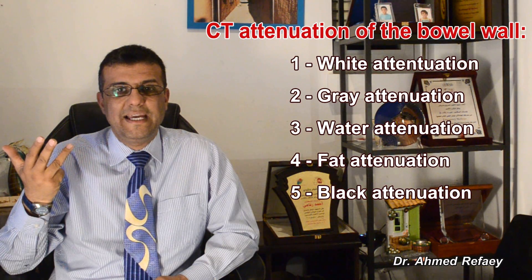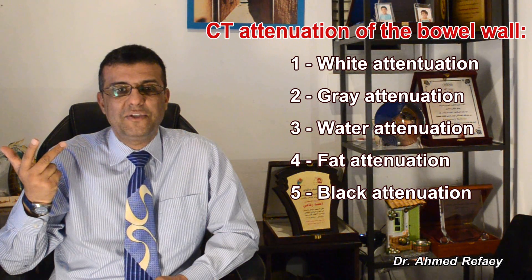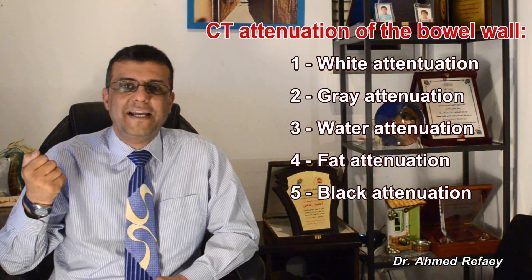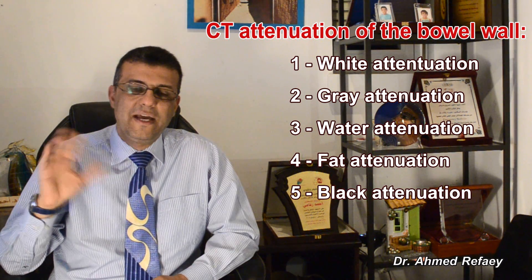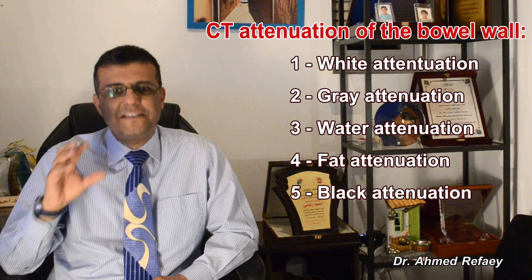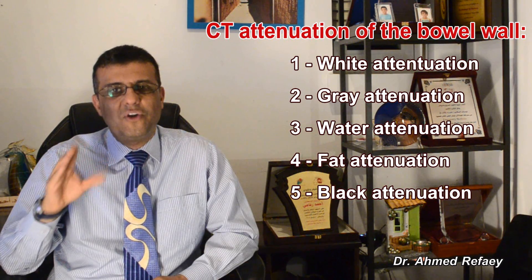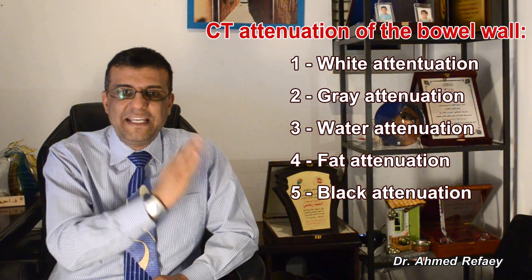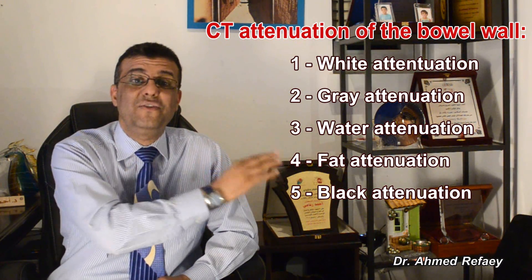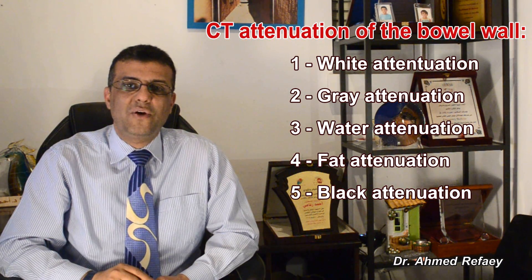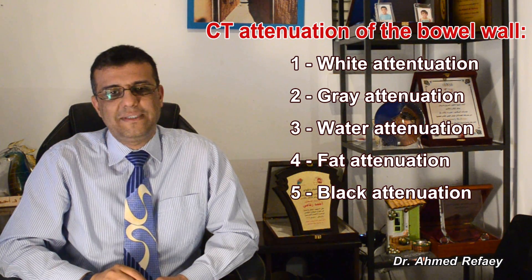The last differentiating feature is CT attenuation of the bowel wall. There are five categories: white attenuation, gray attenuation, water attenuation, fat attenuation, and black attenuation. Starting with white attenuation — it means enhancement of the wall of the bowel to the same degree as the adjacent venous structures, usually seen in inflammatory bowel disease like Crohn's and ulcerative colitis, as well as in shock bowel syndrome.